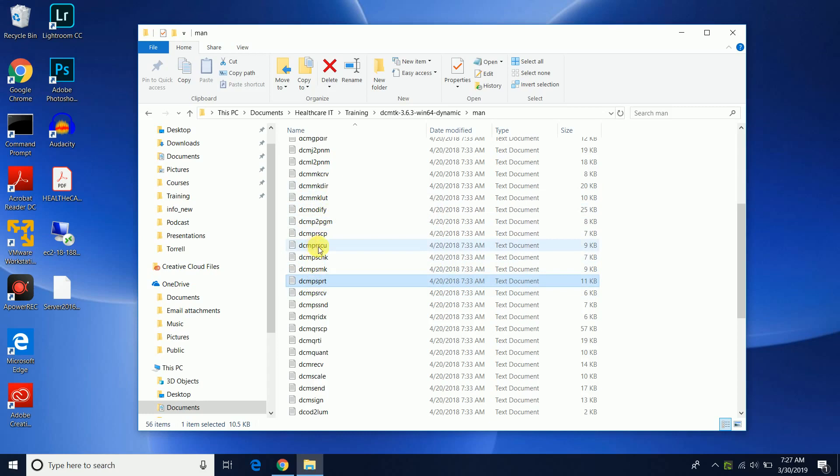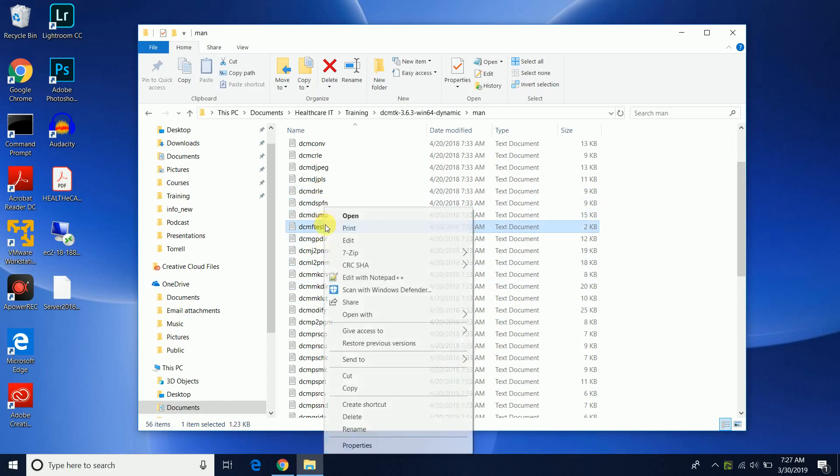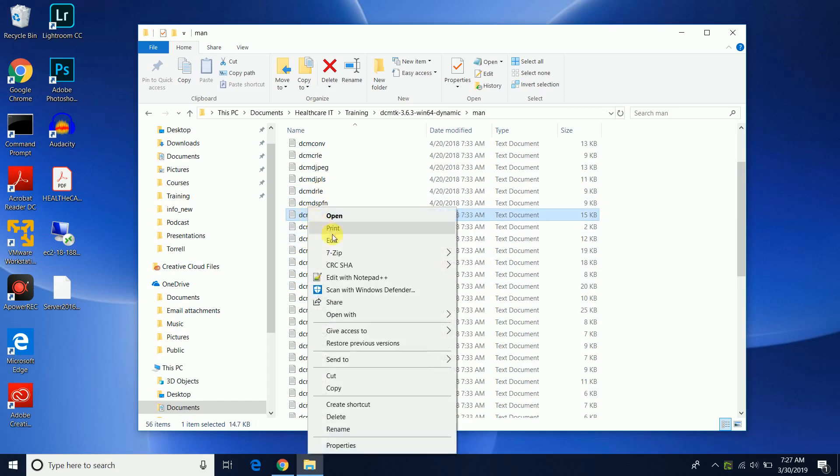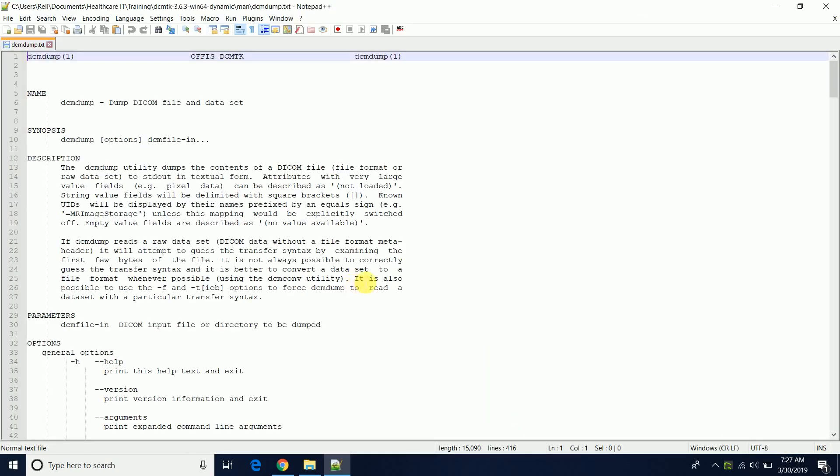So if we actually come and look for the DCM dump, each of these are manual files that gives you a description of the utility. So you can actually come to this directory, take a look at that. It gives you a good detailed description so you have that for reference.